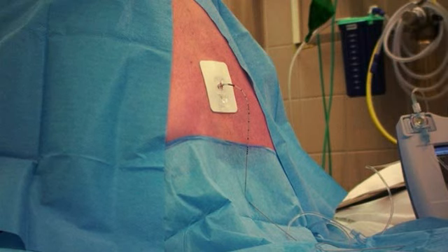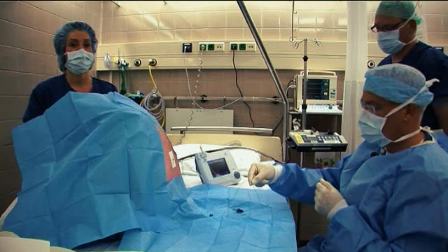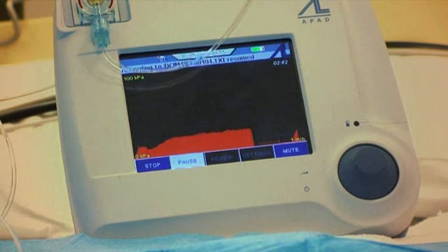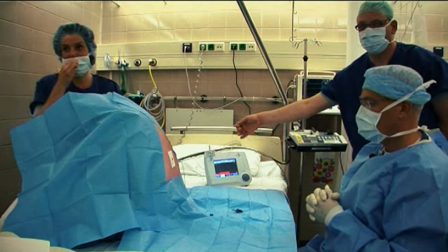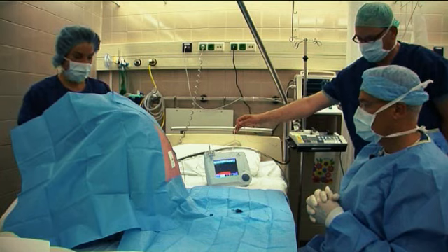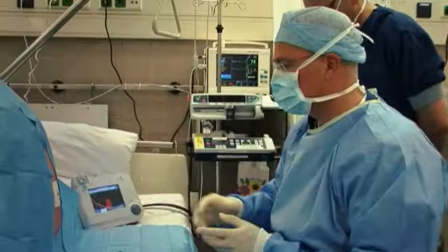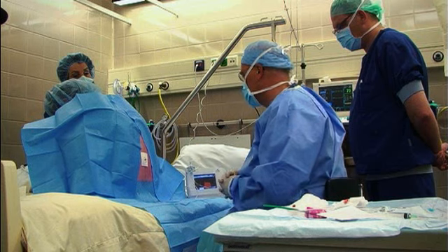Due to the catheter's length and limited lumen, the pressure increases. When the epidural catheter is located in the epidural space, a pressure plateau is created. This means the fluid at the tip of the catheter flows out without any further resistance. If the pressure continues to rise, this means the tip of the catheter is not free. The catheter has to be pulled back slightly.